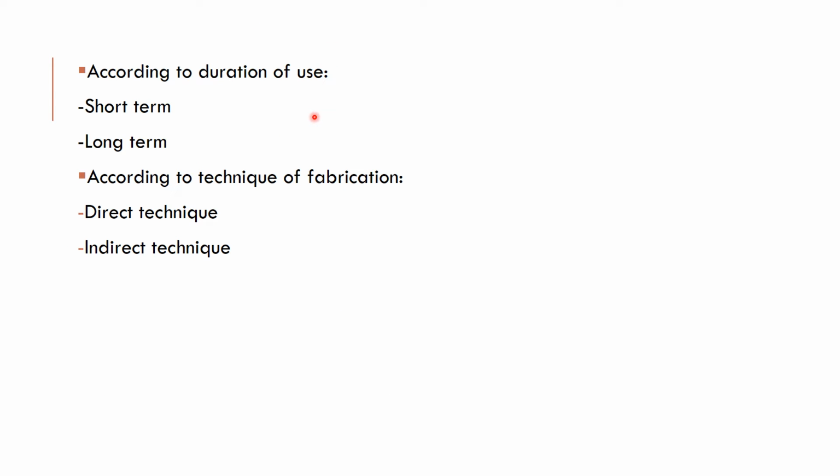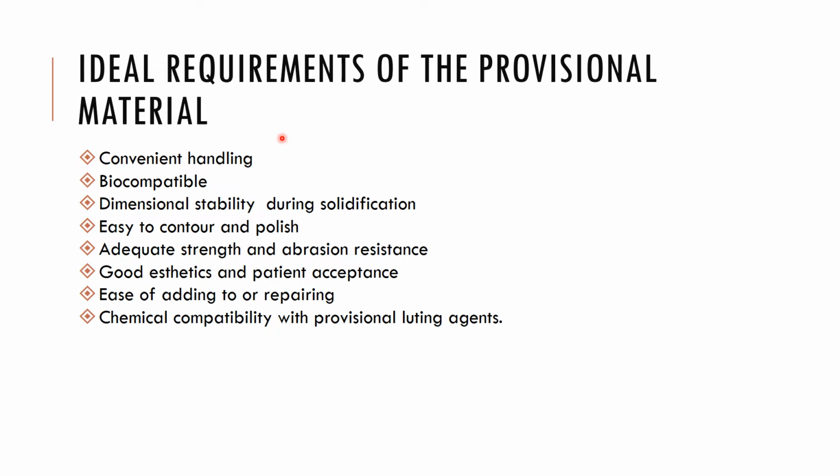According to the duration of use, it is short term or long term. According to the technique of fabrication, direct and indirect. Ideal requirements of the provisional materials.